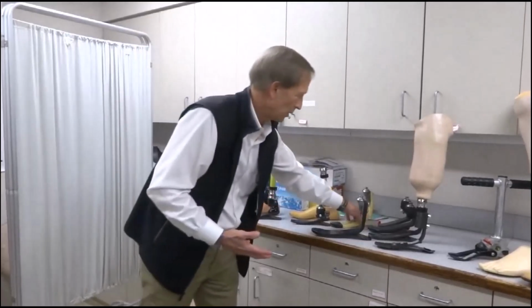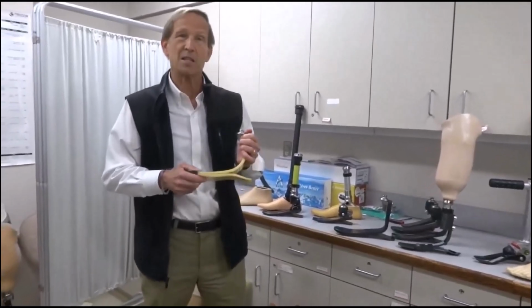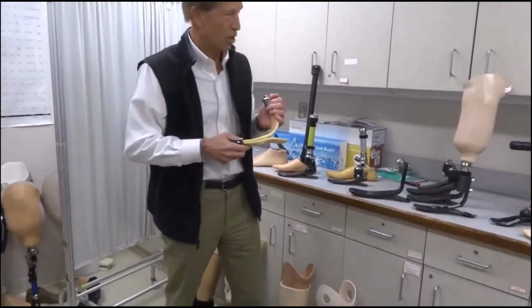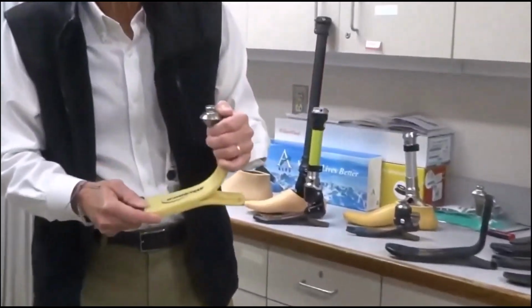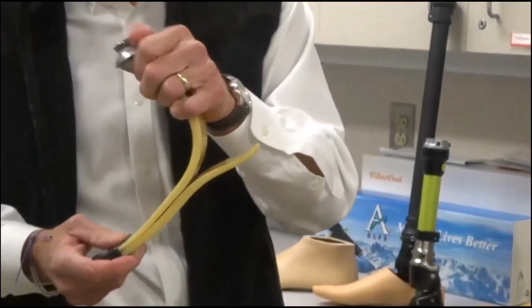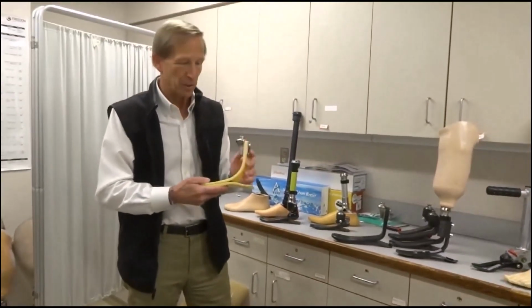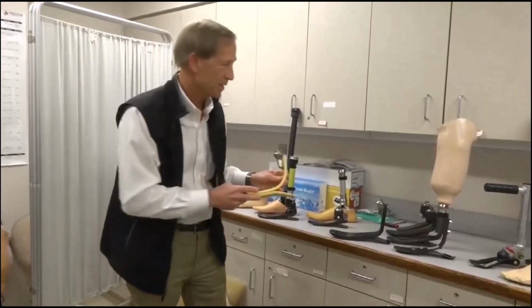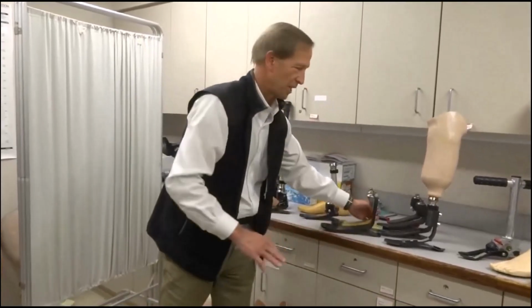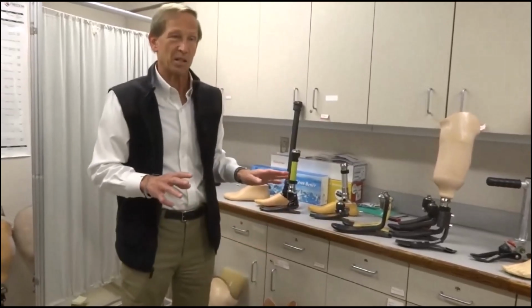Now, the yellow one that's here is a fiberglass composite. Fiberglass has the same type of characteristics as carbon fiber. It bends, it springs back. It actually has a little bit smoother kind of bending motion. So you'll see in the near future that more and more prosthetic feet become fiberglass composite instead of the carbon fiber.